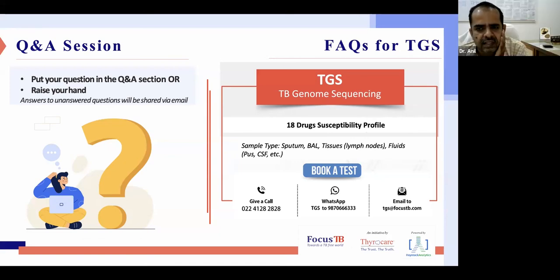It's very interesting that people are talking about NTM when we are discussing TB, because people have gone beyond tuberculosis. It's very good. All AFB is not tuberculosis. There are NTM, so it's not tuberculosis by default. This is the first baby step we are taking with WGS in tuberculosis. The next step would invariably look at NTM and get a full susceptibility profile, so that the treatment is also designed according to the whole genome sequencing. I think that should be the next step in whole genome sequencing in tuberculosis in India.